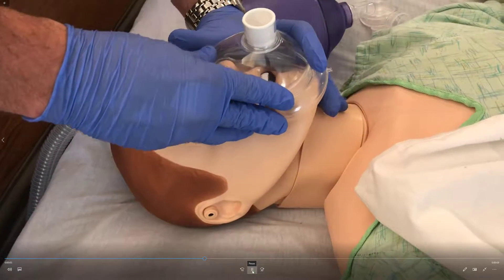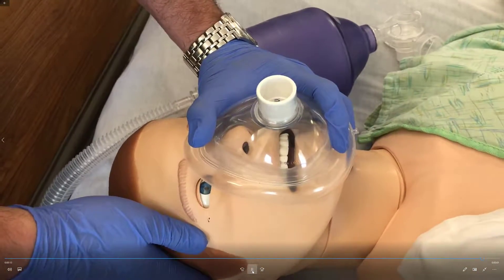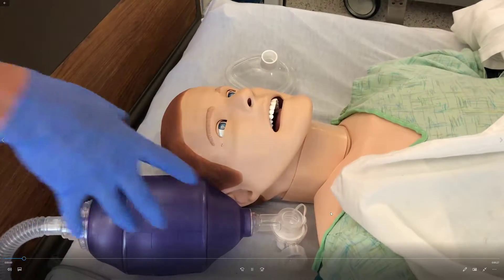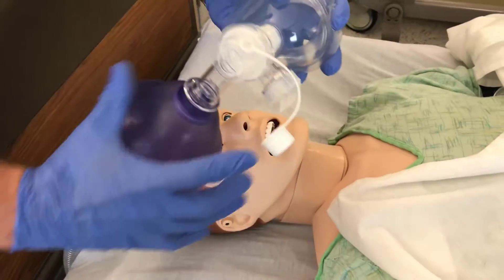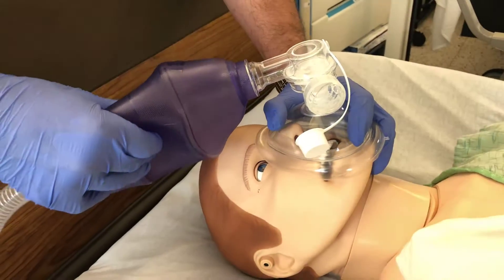This EC clamp helps you get a proper seal on the mask so no air escapes. It's also a good way to help keep the head in the neutral position, because you can take your bottom three fingers and lift up on the chin to maintain that head tilt chin lift maneuver. Next, we'll attach the BVM to the mask — take the cap off, attach the mask, then put the mask back onto the patient using your EC clamp.